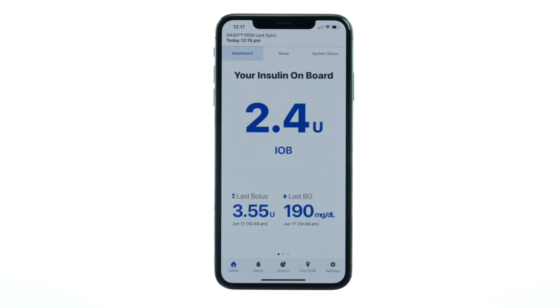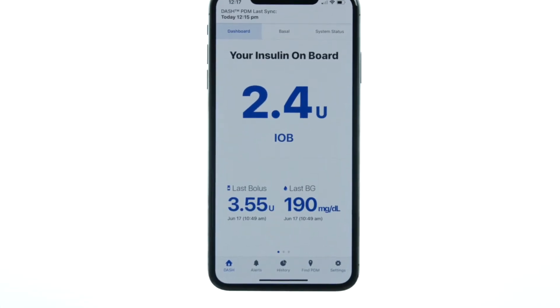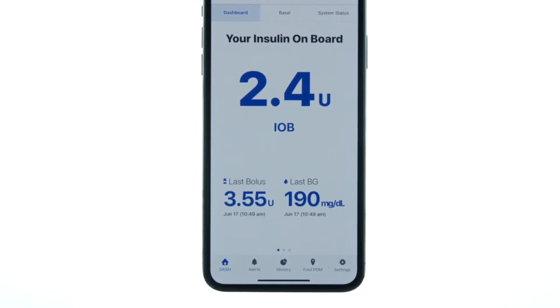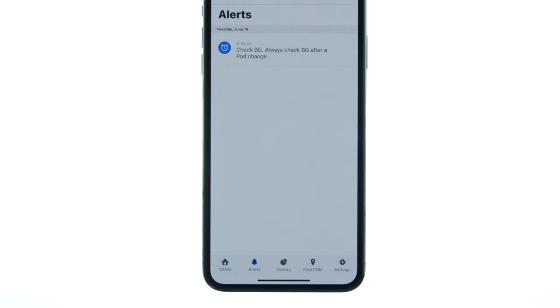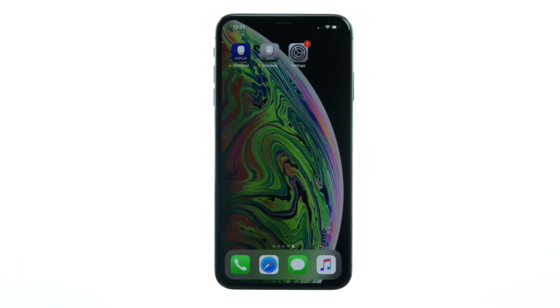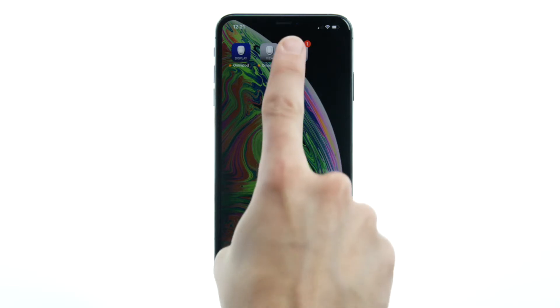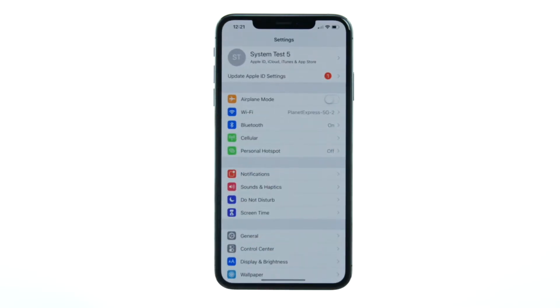Notifications and alarms can be viewed on the Alerts screen within the Display app. To be notified each time a new message arrives, from the iOS home screen, tap Settings, then tap Notifications.